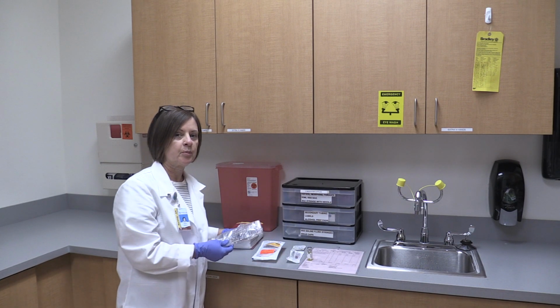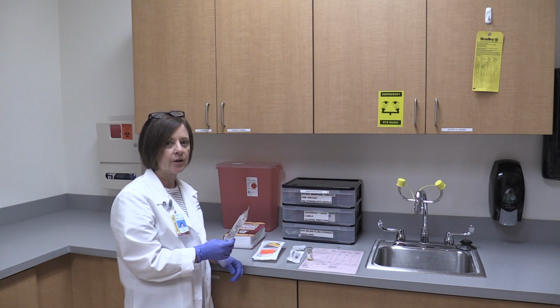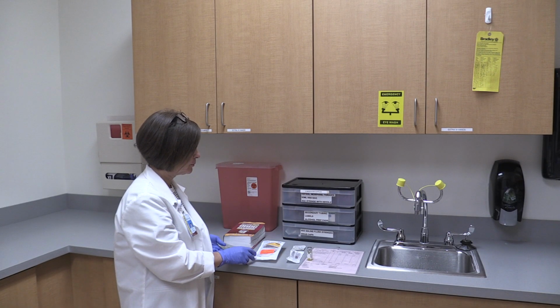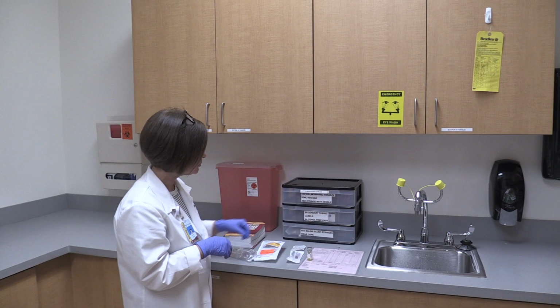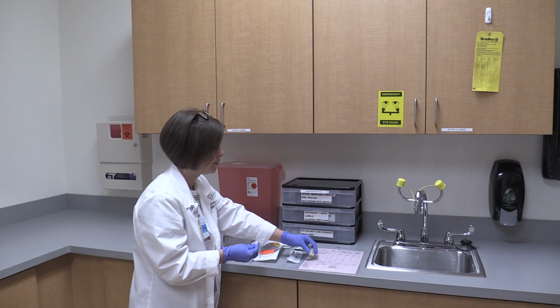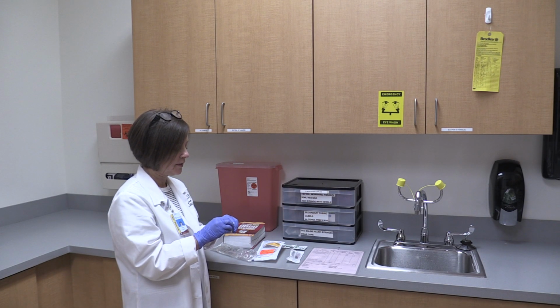I want to use my drug book or a compatibility chart to make sure that the Kefsol and the saline are compatible. I can also verify that they are compatible with the infusion that's already running on the patient. First thing I'm going to do is clean my Kefsol vial for 15 to 30 seconds.